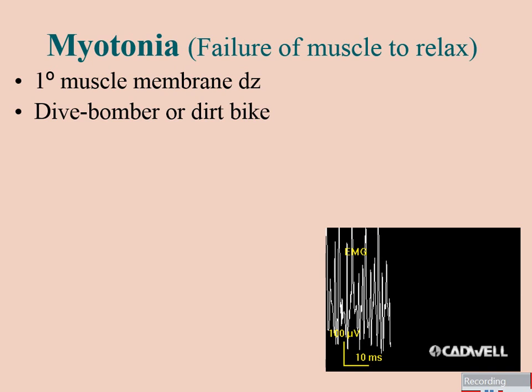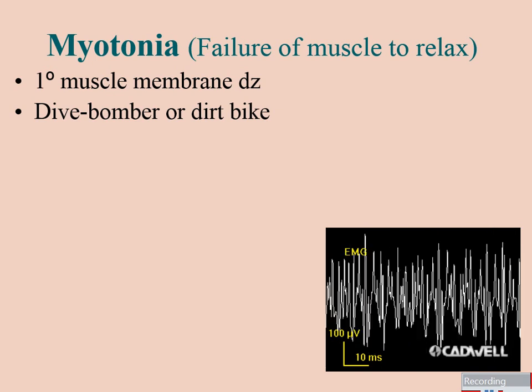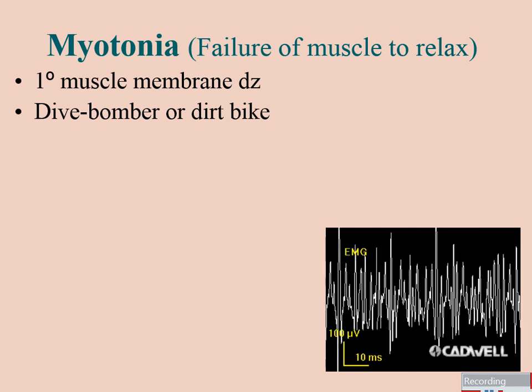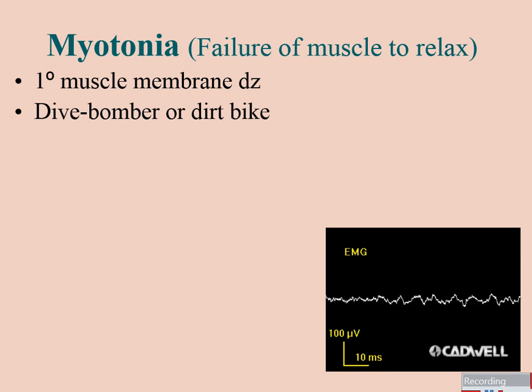Although Kimura, who wrote the Gospel on electrodiagnostics, says in his book, he's an older guy now, I have lots of experience with dive bombers, and these don't sound like dive bombers. Apparently he was in World War II in Japan. So he doesn't think they're dive bombers, but that's what everybody thinks. They have this musical kind of quality to them that waxes and wanes, and that's where the dive bomber sound comes from. But notice there's an abrupt end there to one of the sounds, and listen here. Boom! It shuts off very suddenly.